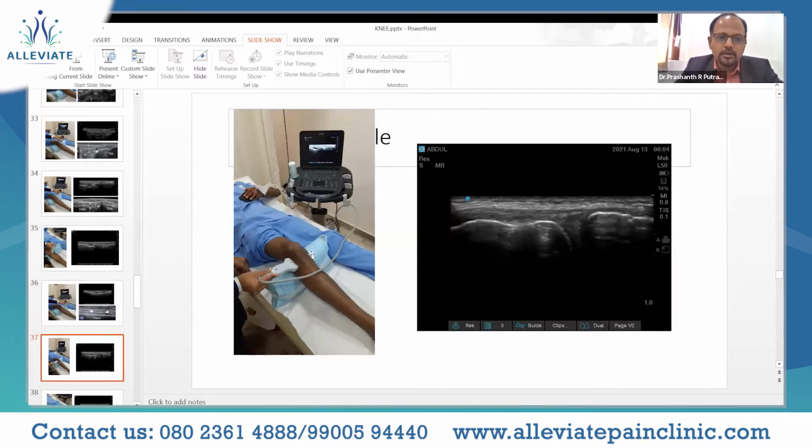And then moving on to the lateral aspect of the knee joint, again we'll be seeing the two bony shadows. The marker is always placed cranially, right? So cranially would be the femoral condyle, and then inferiorly would be the tibial condyle. Again, you can see a triangular portion, the lateral meniscus, and then the portion of the joint capsule above.